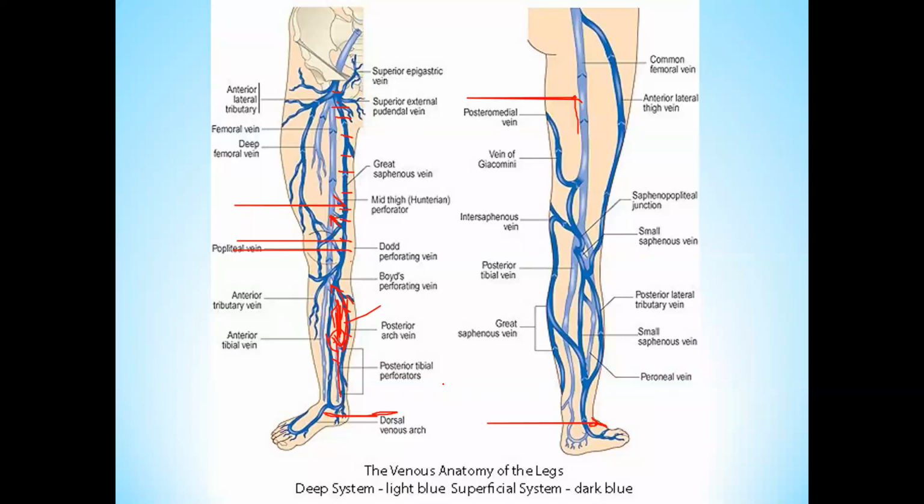The wall of the arteries should be interrogated for any calcification or deposits, because you will have multiple deposits in cases of arteriosclerotic disease. So in cases of early arteriosclerotic disease, the blood flow velocities will be the same, meaning there will be no hemodynamic change, but only calcium will deposit in the vessel wall.